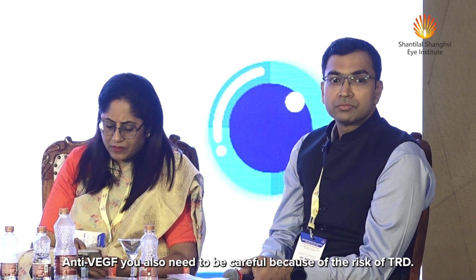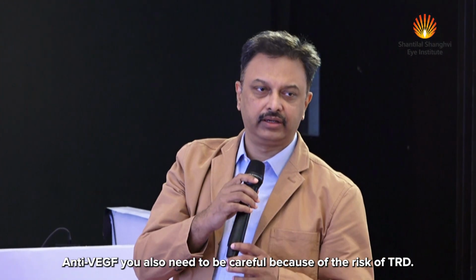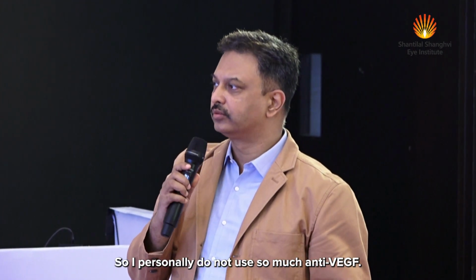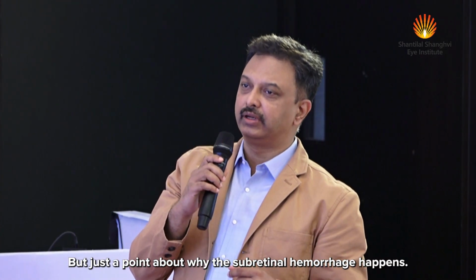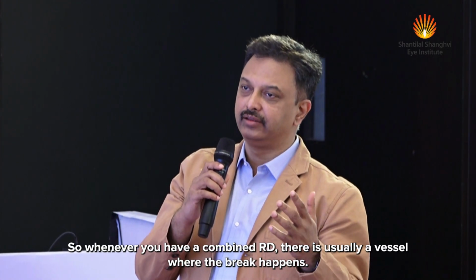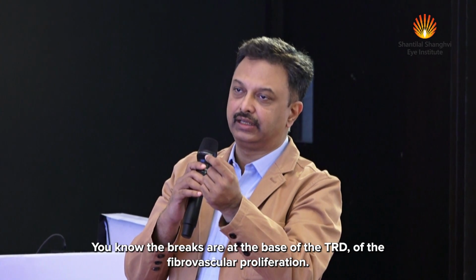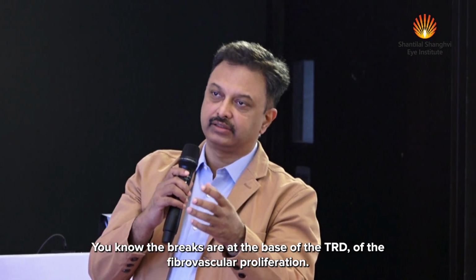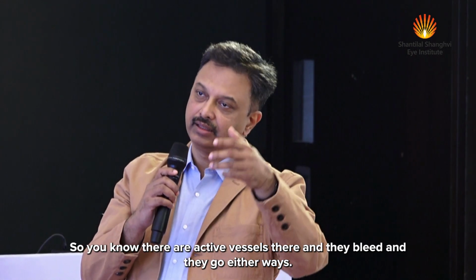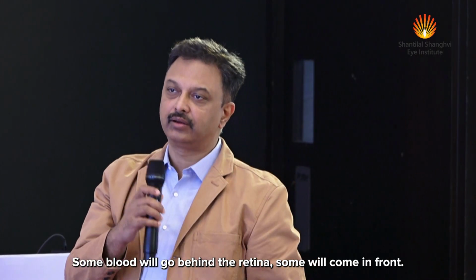Similar question to Dr. Basu, if you want to add. With anti-VEGF, you also need to be careful because of the risk of TRD. So I personally do not use so much anti-VEGF. But just a point about why the subretinal hemorrhage happened. Whenever you have a combined RD, there's usually a vessel where the break happens. The breaks are at the base of the TRD, of the fibrovascular proliferation. So there are active vessels there, and they bleed and go either way. Some blood will go behind the retina, some will come in front.